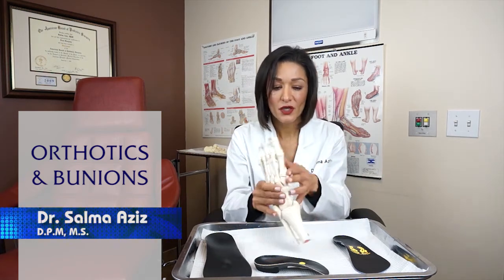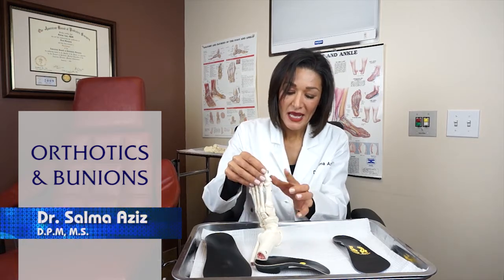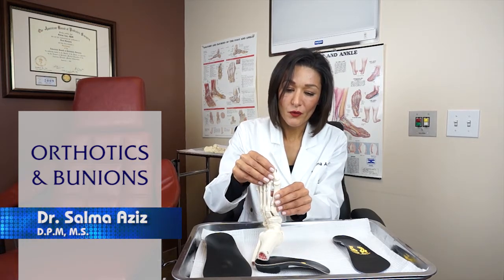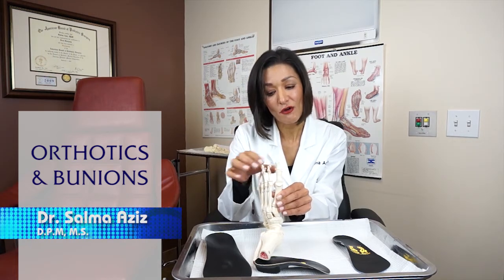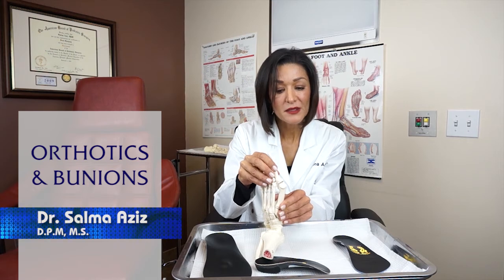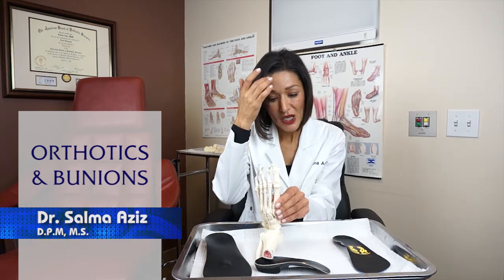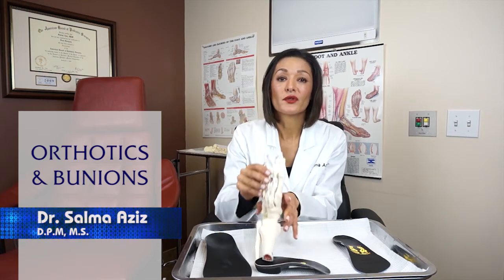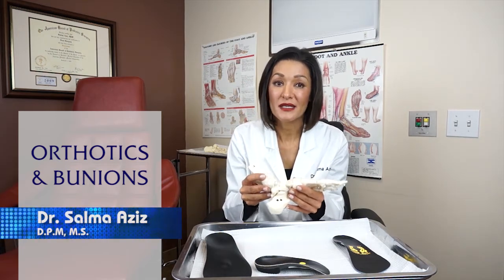This imbalance creates the following, and we have done this before, but a quick recap. The big toe joint moves closer to the midline of the body. The big toe goes closer to the pinky toe, the smaller toe, creating this painful bump, also known as a bunion. So the way we prevent this, or the way we slow down this deformity, is by means of an orthotic.